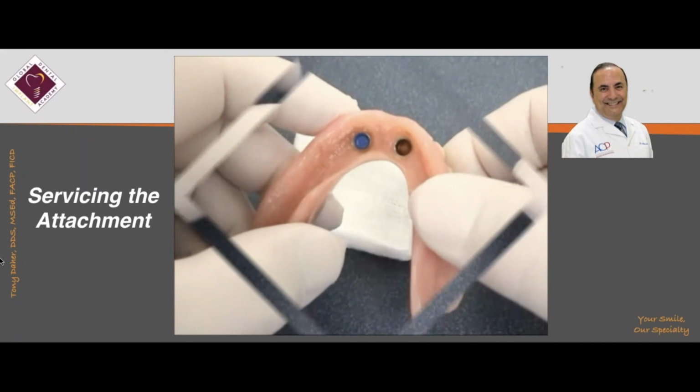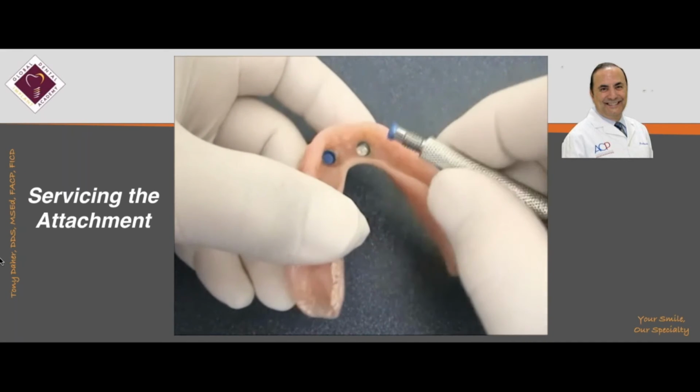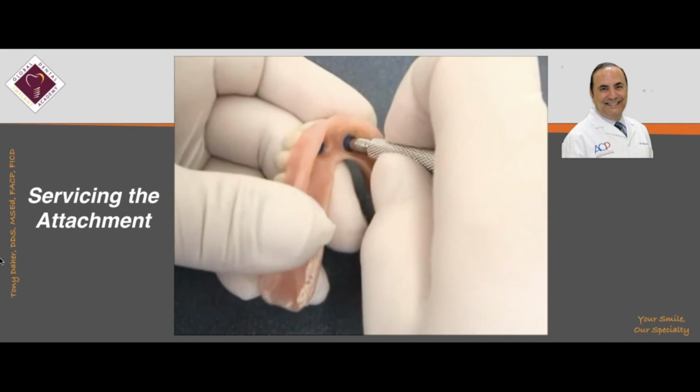And it should snap in. If everything is fine, it should snap in.